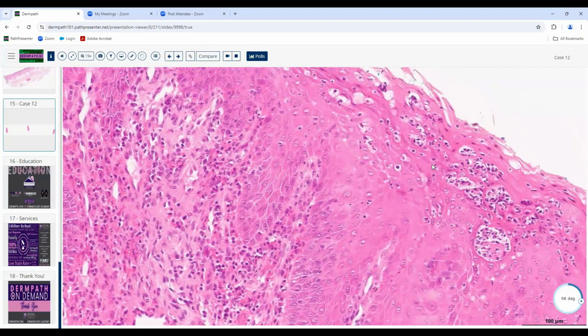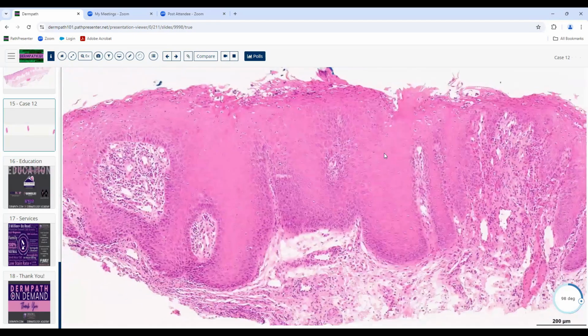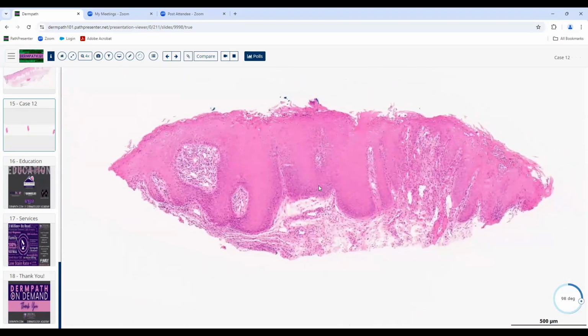So beware of pseudocarcinomatous hyperplasia looking like cancer, getting overcalled as cancer. And, you know, it's a pretty aggressive thing if you call a cancer of somebody's lip that's inflammatory. That's usually a pretty aggressive surgery. They'll do like a wedge excision of somebody's lip. So you don't really want to have that happen in a situation like this. This one's not as hard because this really doesn't look all that atypical, but sometimes you'll see these that really look very atypical and really can simulate a squamous cell carcinoma, but it's only candidiasis.